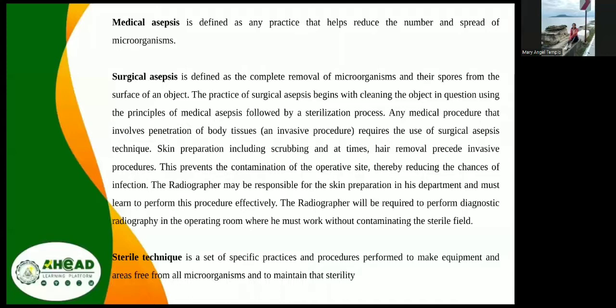The radiographer will be required to perform diagnostic radiography in the operating room, where he must work without contaminating the sterile field. Sterile technique is a set of specific practices and procedures performed to make equipment and areas free from all microorganisms and to maintain that sterility.